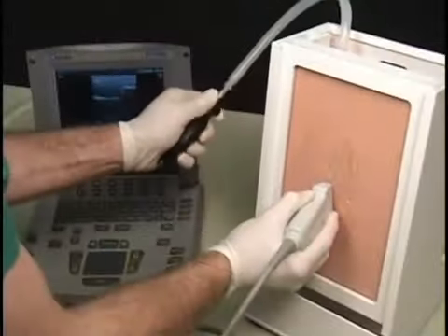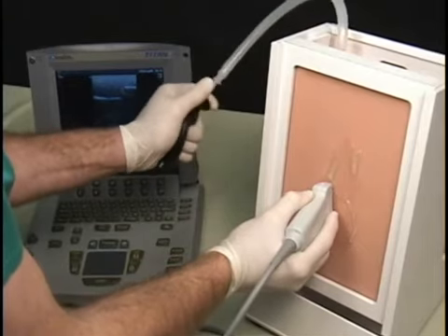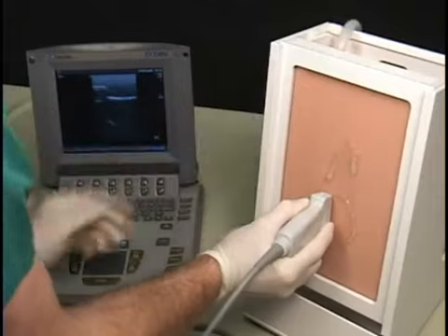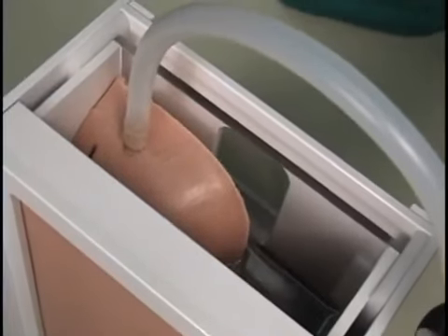The lung and diaphragm can be seen as echogenic structures, and the lung is equipped with an inflation mechanism so that the size of the pleural effusion can be adjusted. The model also features an open top, which enables the instructor to provide feedback on procedural concepts by allowing students to visualize the catheter depth and placement within the pleural cavity.